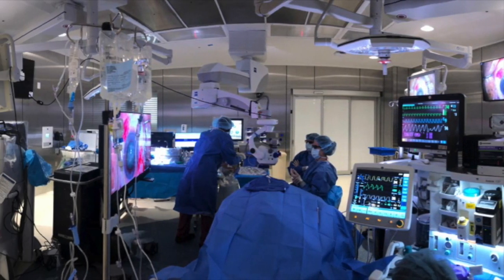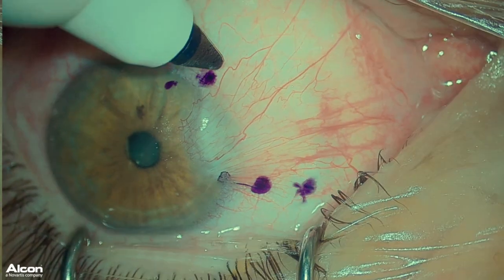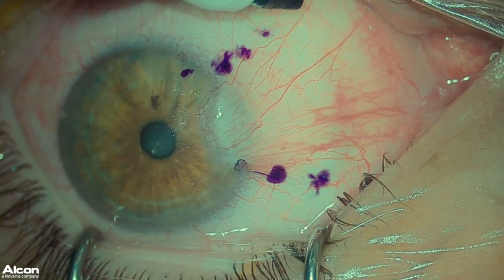This is showing the operating room setup using the Ingenuity system. The first step is to mark out the extent of the pterygium.